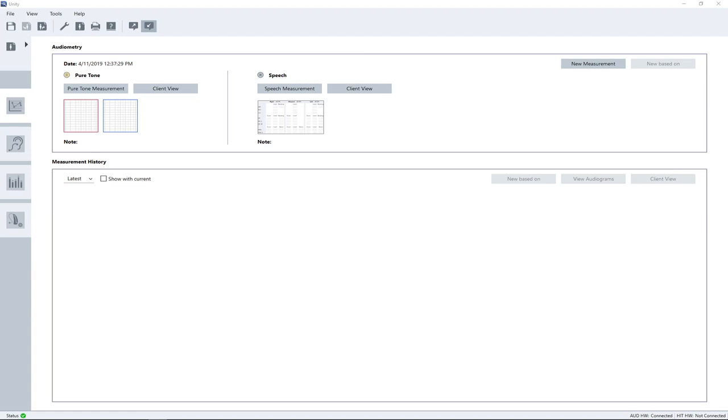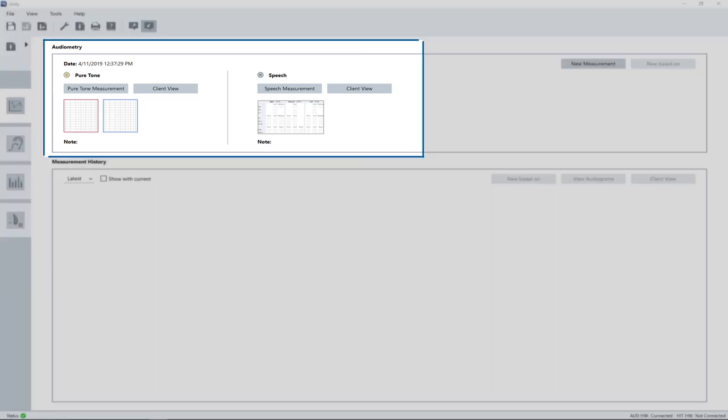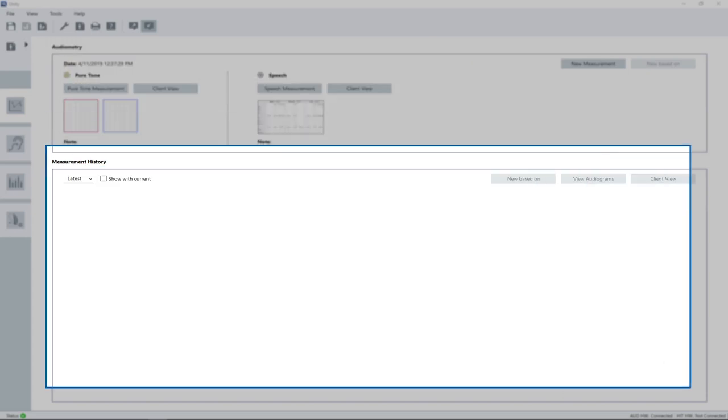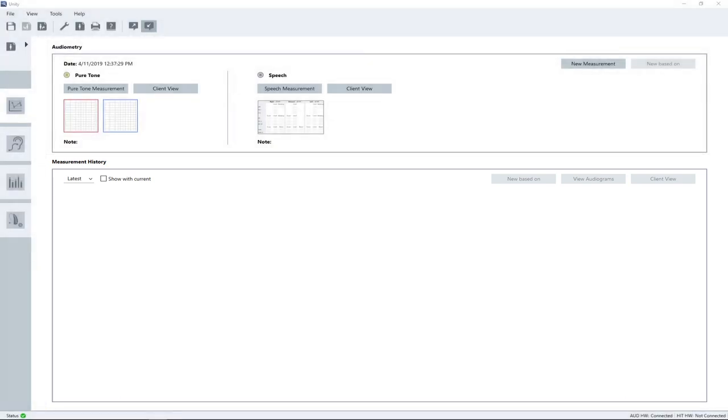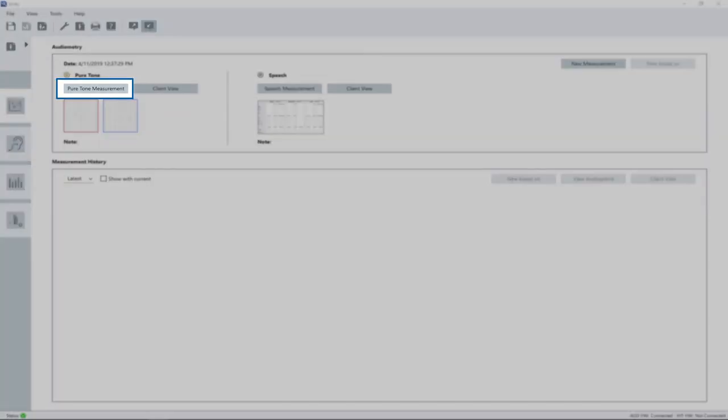On this page, you can choose between pure tone and speech measurement. A list of the previous audiometric measurements is displayed at the bottom of the screen. To open the audiometer workspace, click the pure tone measurement button.